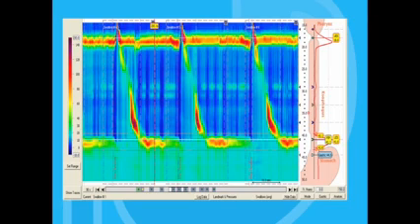You can see another red pressure band at the bottom of the tracing, which is the esophagogastric junction. And you'll also see periodic relaxations with the solicited swallows. In the middle of the tracing, you will see the peristaltic pressure wave in the body of the esophagus.